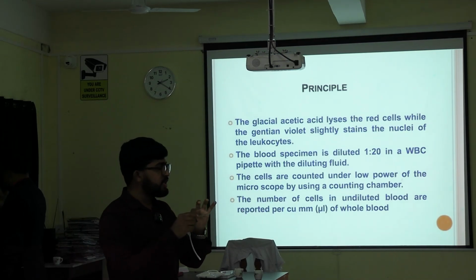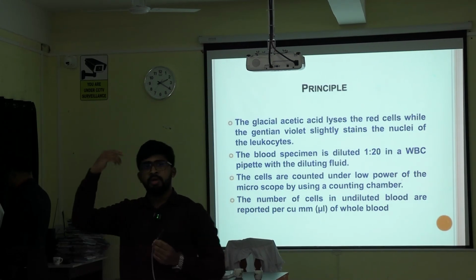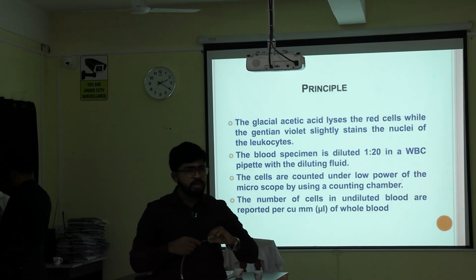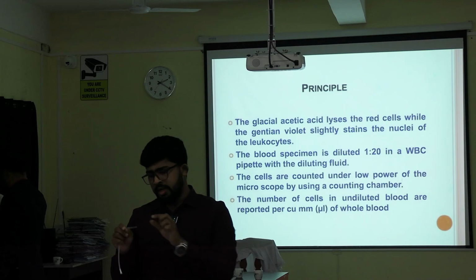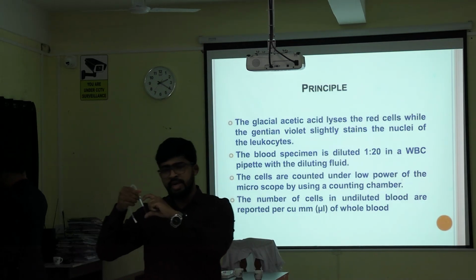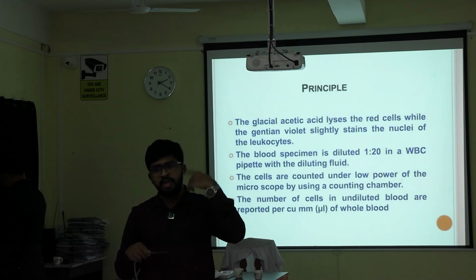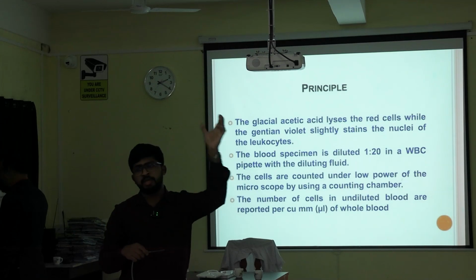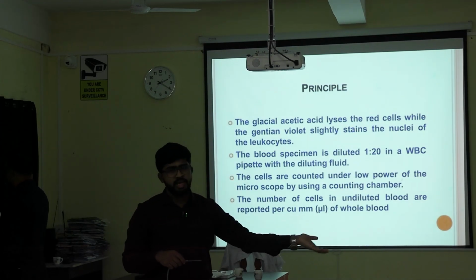101 is the grading. What was the dilution? 200 dilution. How did it come to 200? You took 0.5 part of blood, then you took fluid till 101. In the part before the bulb, whatever fluid was there, this basically didn't get mixed with the blood you took. So 0.5 part blood was present in 100 parts of fluid, the RBC diluting fluid.